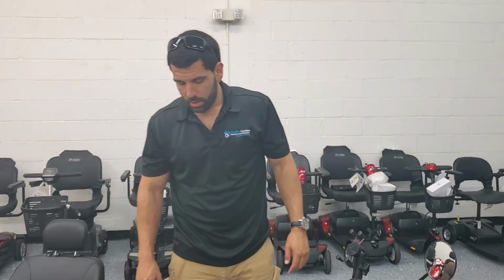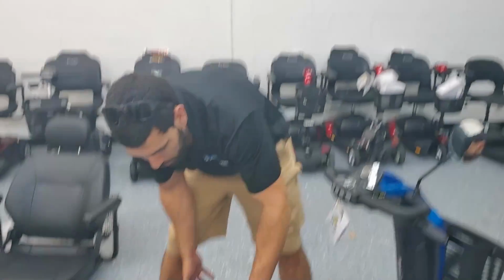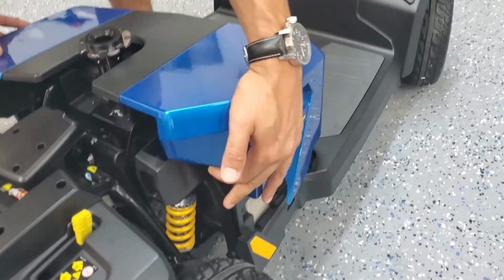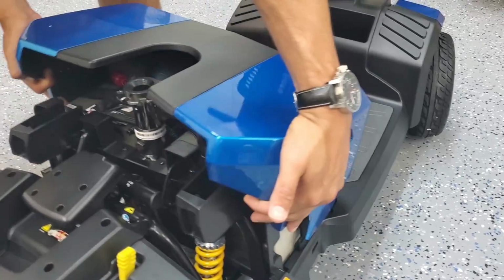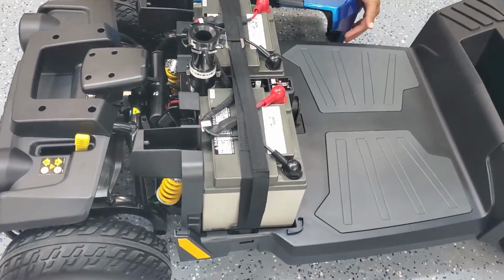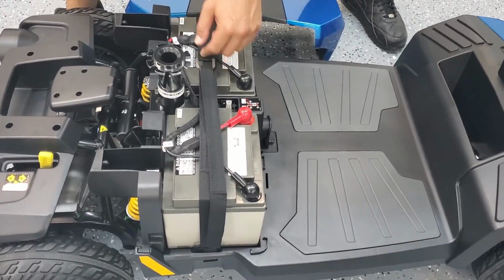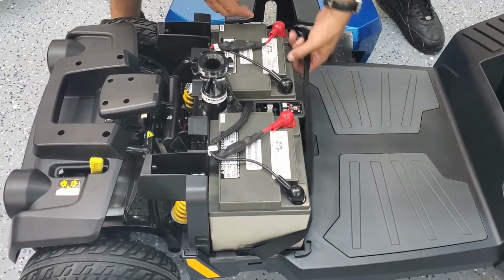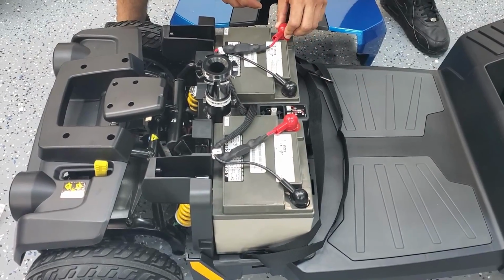All right, now one thing you're going to have to do before powering it up for the first time, you're going to have to get the seat off, and you're going to have to take out the shroud cover, which if you just pull out from the outsides and lift it up, you'll see that you can expose the batteries. Now this is a heavy duty unit, just like the ZT10 video that we just did not too long ago. You can see the batteries.